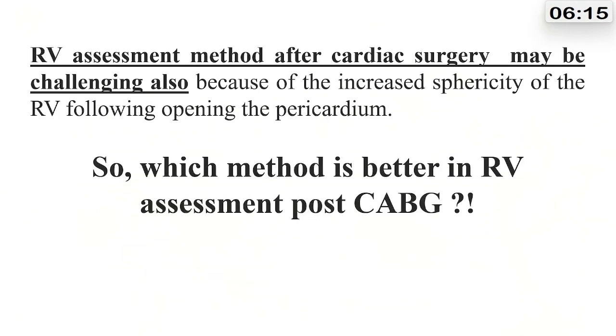Maybe an explanation of this finding is that RV assessment after cardiac surgery may be challenging also because of increased sphericity of the RV following opening of the pericardium.